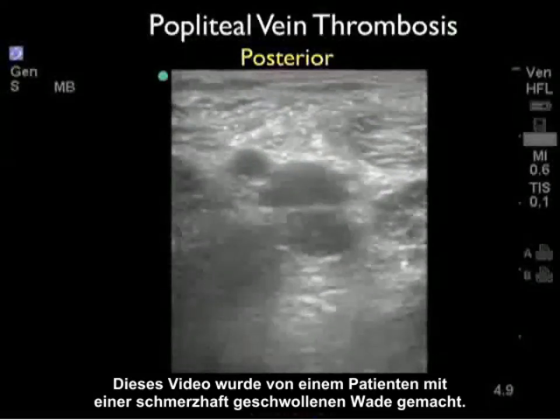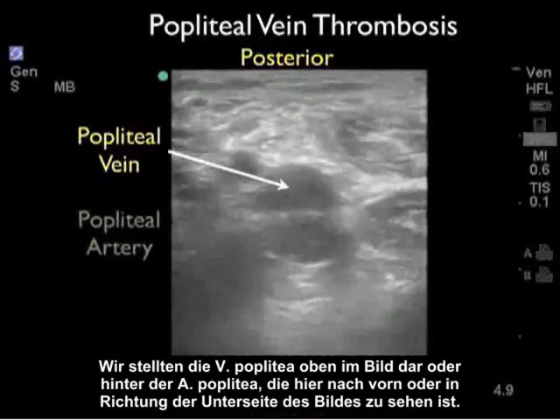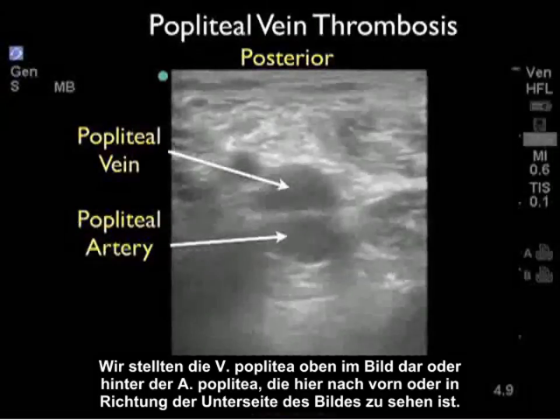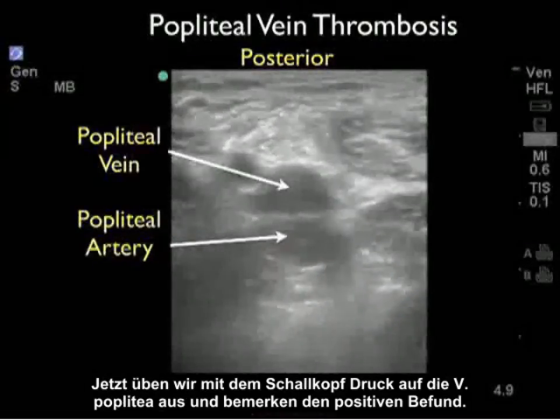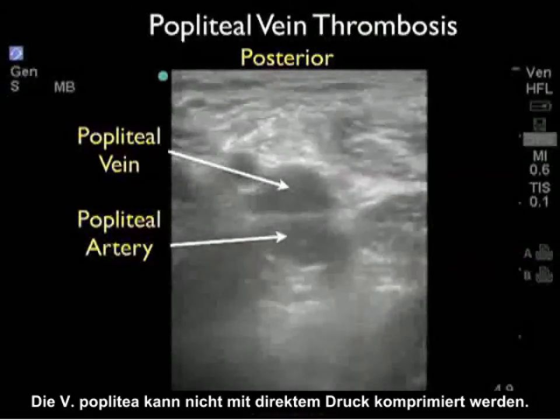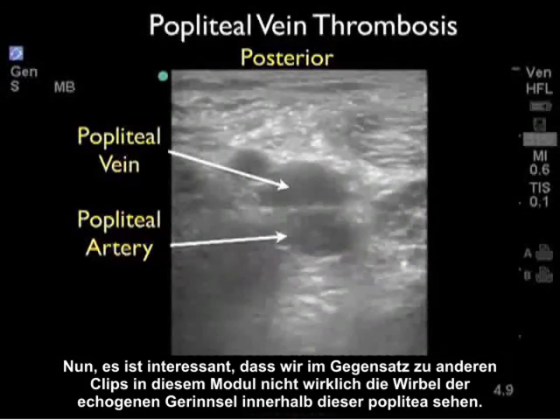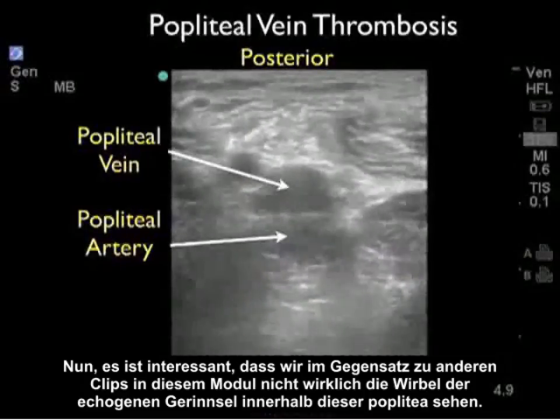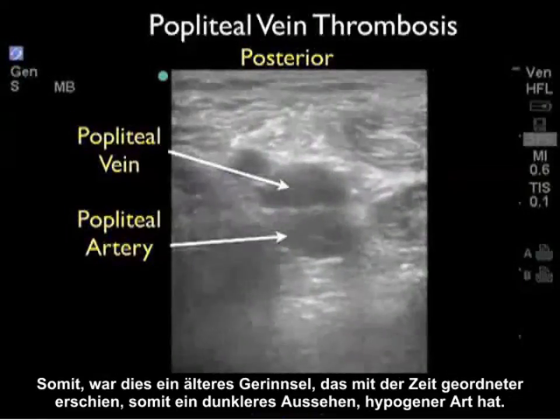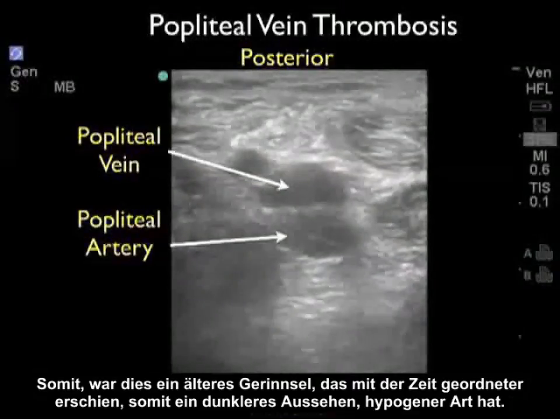This video clip was taken from a patient who presented with a painful swollen calf. We identified the popliteal vein towards the top of the image, posterior in relation to the popliteal artery seen anteriorly or towards the bottom of the image. Pressing down with the probe and applying pressure to the popliteal vein, we notice a positive finding — the popliteal vein fails to compress with direct probe pressure. Interestingly, we don't really identify swirls of echogenic clot within this popliteal vein. This was an older clot that had been more organized with time, giving a darker, more hypoechoic appearance.